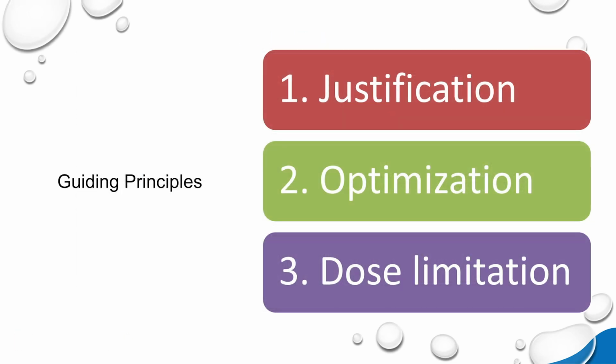So when we think as a radiologist, we have 3 major guiding principles. The first principle is justification. Basically, justification is telling you that a dentist should identify the situation where the benefit to the patient from the diagnostic exposure, when you're taking your radiograph, exceeds the risk.